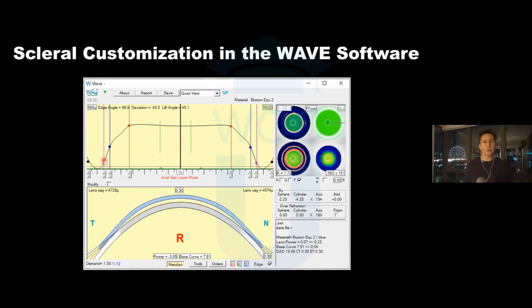And this is so powerful in a scleral lens because we're trying to optimize quite a few things. We need to get that alignment with the conjunctival surface optimized. We want the limbal vault. We want to protect the limbal stem cells. Then we want to create vault over the entire cornea, especially if it's in a diseased eye. We want to protect the diseased tissue.